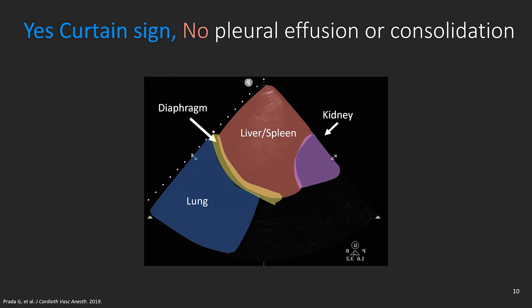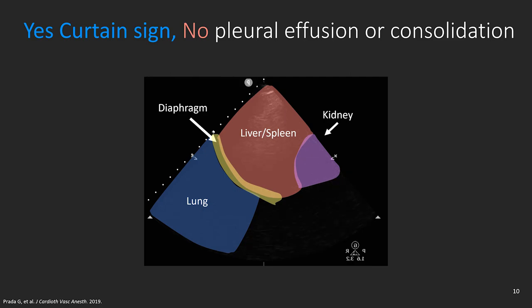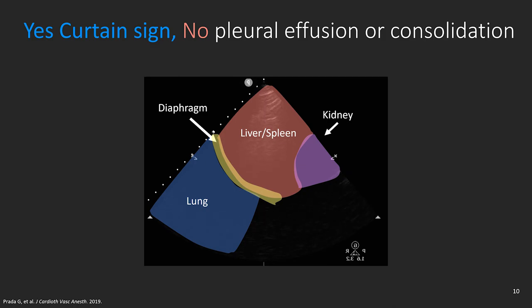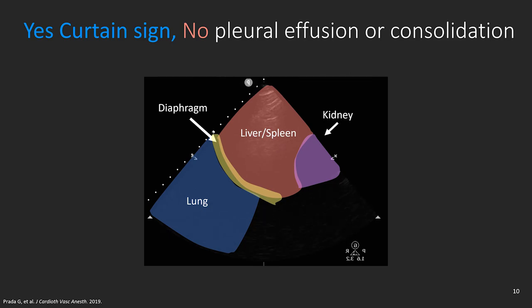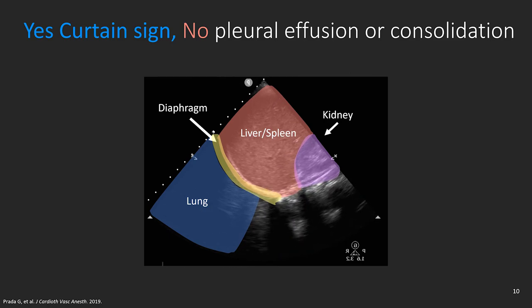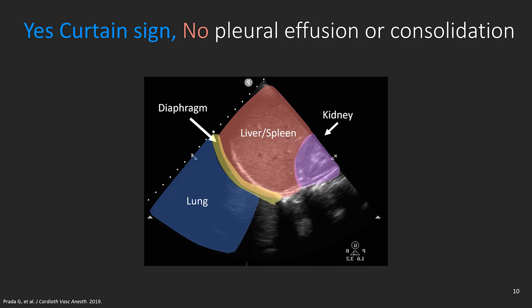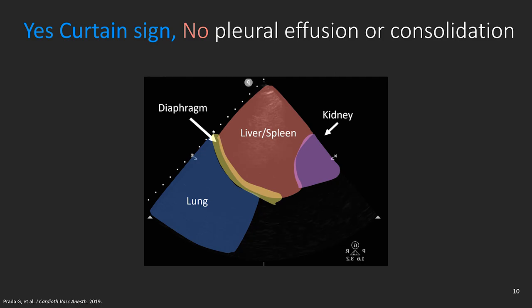If you have a pleural effusion, no matter how deep the patient inhales, the effusion will always be there between the lung and the diaphragm separating both, and you will always be able to see it. If you have a consolidation, you would see it as a bright area, not as the black shadow seen in a healthy air-filled lung. No air-filled lung means no black shadow, and no black shadow means no curtain sign.